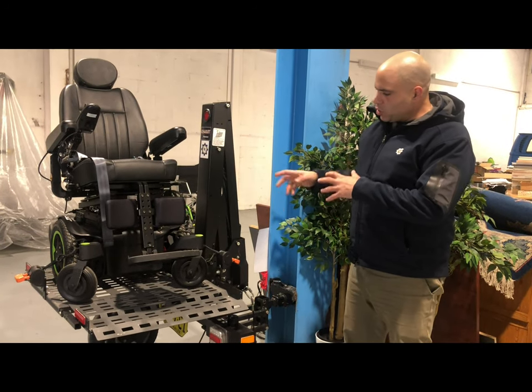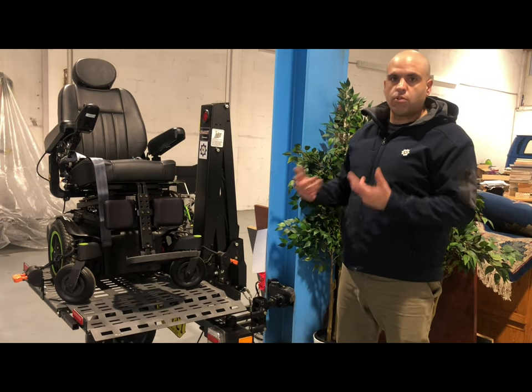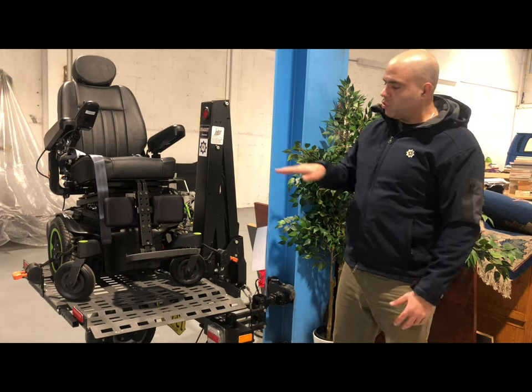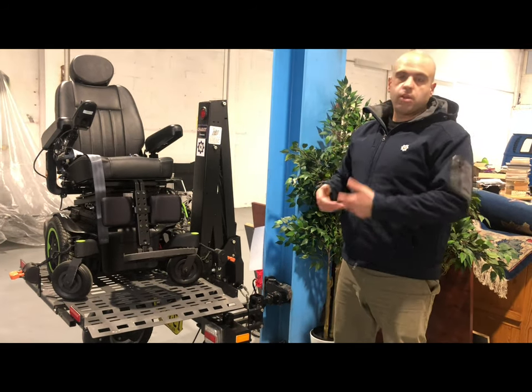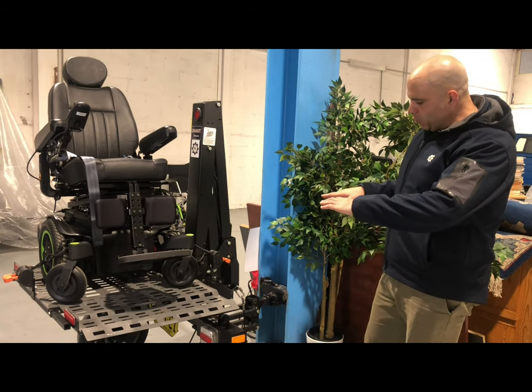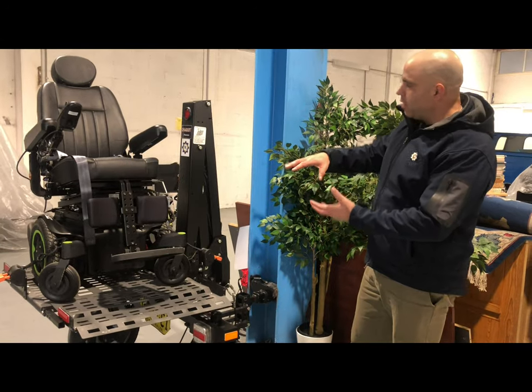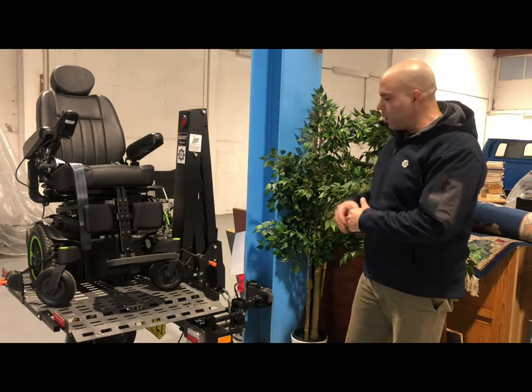The great thing about it, which I'll show you in a second, is that you can actually walk on and off it, or drive on and off it. If you're a scooter user, you can drive your scooter straight onto this platform, get off it, walk around to your car and drive off. Right now this is in driving mode — up in position — and you can get special covers for your wheelchairs so it can be fully weatherproof.